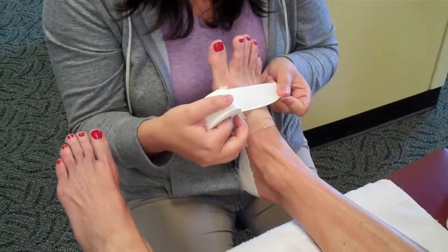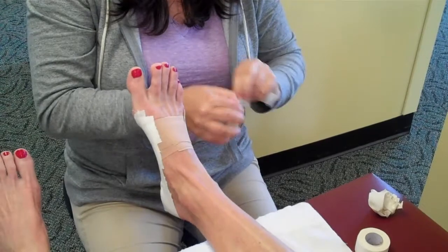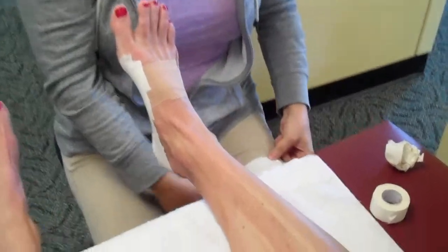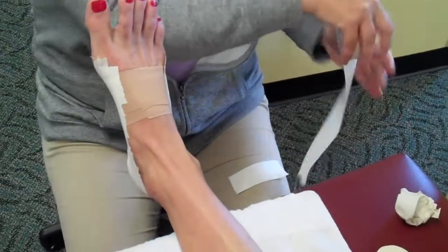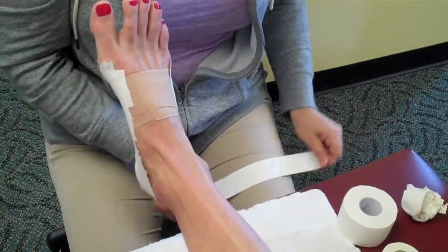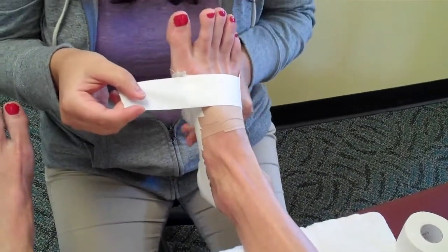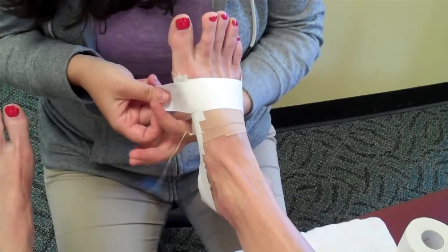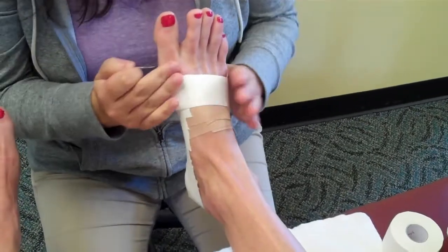Just to prevent this part from peeling off, I'll either lay one strip directly on the skin, or I take a small piece and a long piece of the one and a half inch tape, stick them together, and then just slightly wrap around the foot to finish it off.